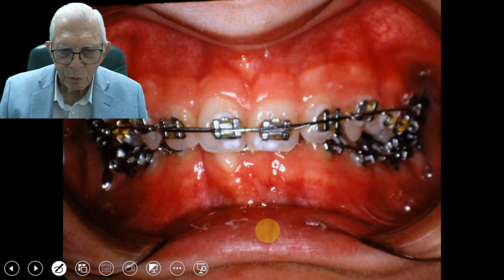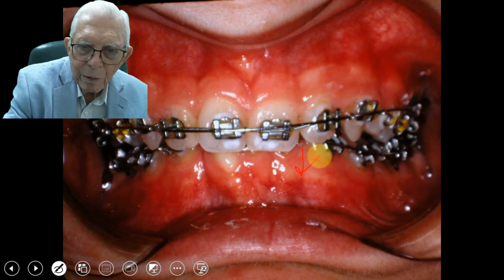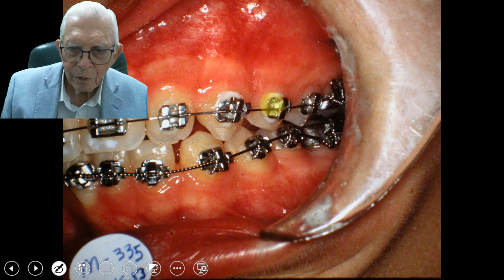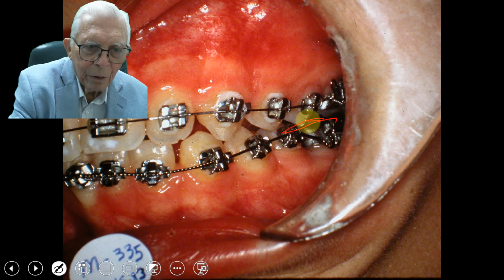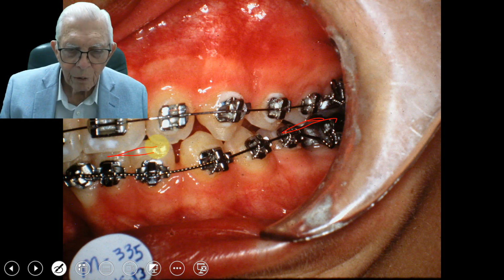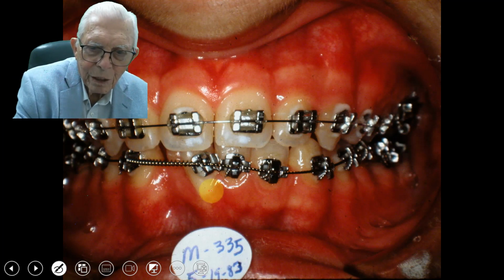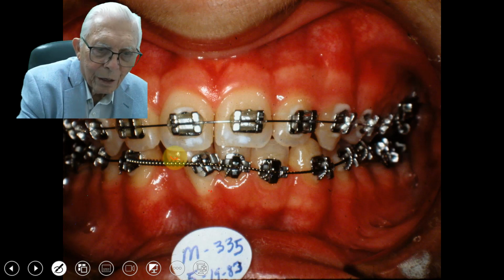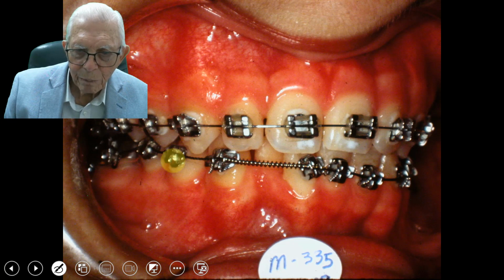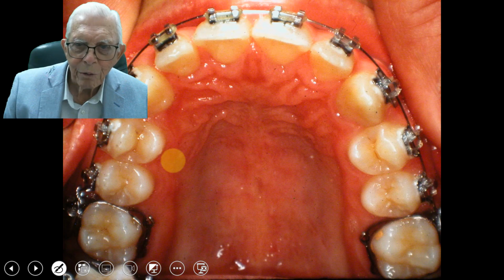Now we're still bringing the bottom teeth down, you see, and we may pick this up a little bit more to do that. Now we've got them down, we've got him closing back here, and this is opened up here. This is what I wanted to show you. Now we're moving that bottom jaw forward. We've got this cuspid, the lateral right here is out. We got an impacted one back in that side, and we kept expanding that, bring it down, and this took a little longer to do than a regular case.